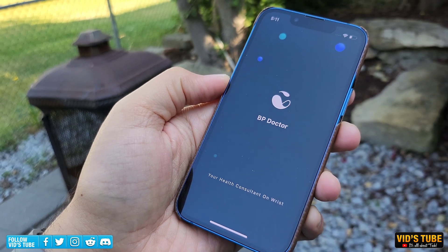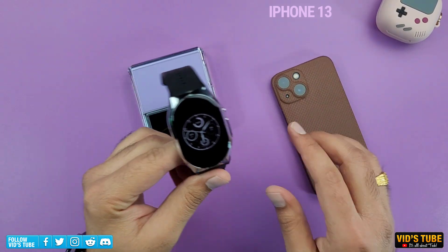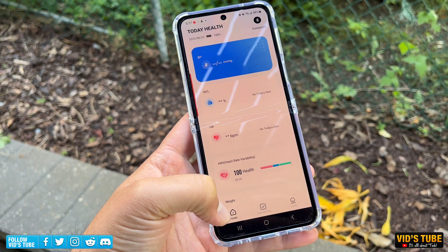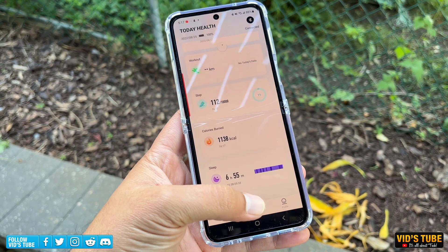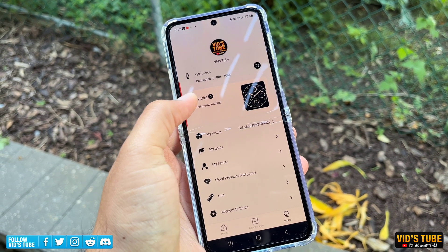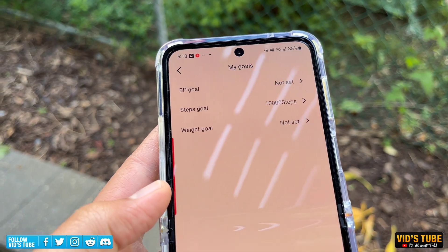Just download the BP Doctor app, available for free on both the Apple App Store and Android Play Store. I have tested this watch on both my iPhone 13 mini and, for this video, it is paired with my Galaxy Z Flip 4. The app is pretty user friendly with three tabs at the bottom. First is Health — your health dashboard where you can find all your health stats. Calendar Plan is where you can schedule alarms or events. Finally, Profile is where you can find all important device settings, notification settings, watch face options, account details, and goal setting.